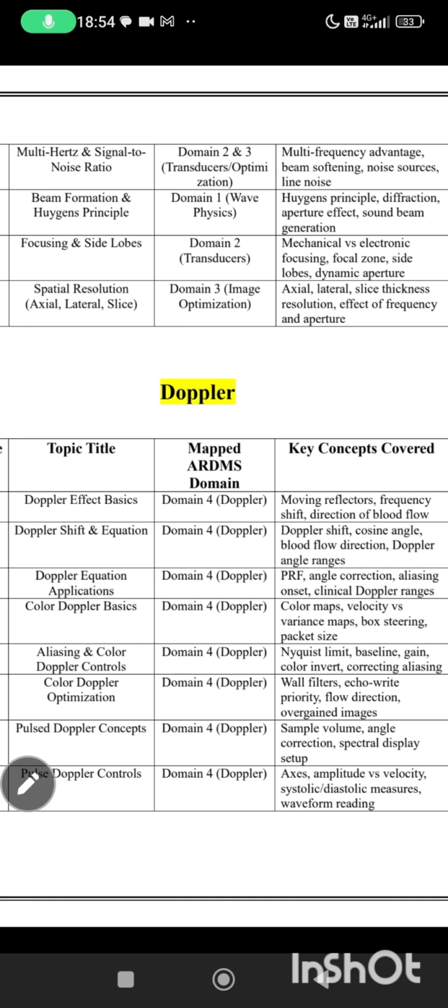In pulse Doppler, there is a sample gate. And the sample gate itself is very important. Images. What is the correct positioning of the sample gate? It should be in the center of the vessel. It should not be close to the wall. Its size should be 1/3 of the vessel diameter. It should be in the center and it should not be very large. And what happens if you place it at a wrong location, near the wall or very large? There is spectral broadening artifact.